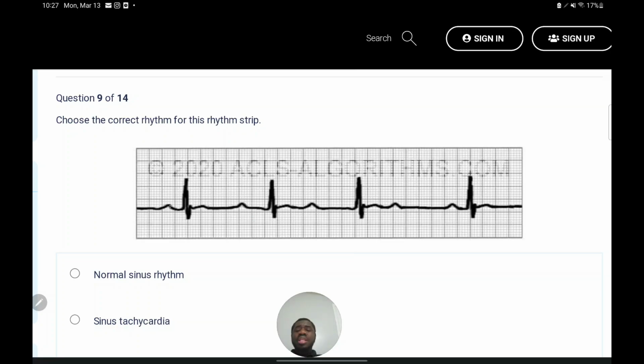So the husband is separating from the wife and the kid. In the second cycle, the husband is increasing his distance from the wife and the kid. And in the third cycle, the husband has separated. The distance between the wife and husband is so big that there's no communication. I mean, the communication from the husband to the wife has to take a long time.